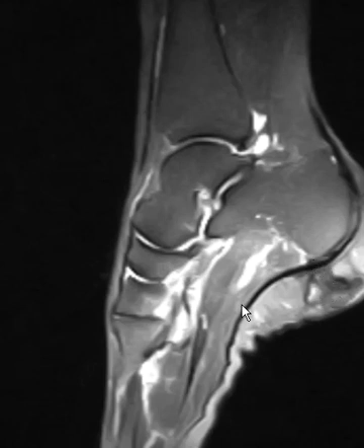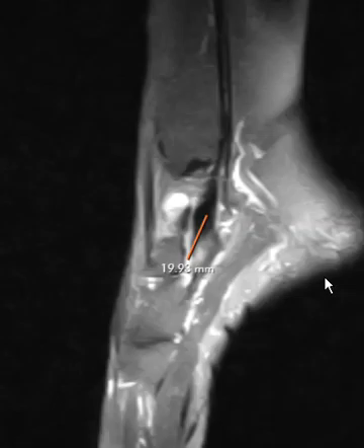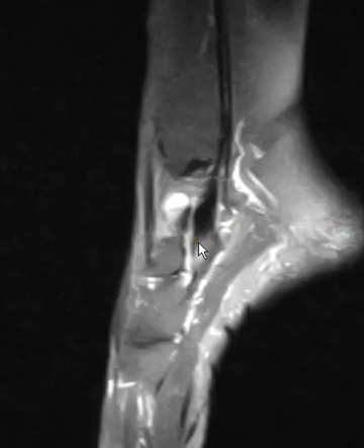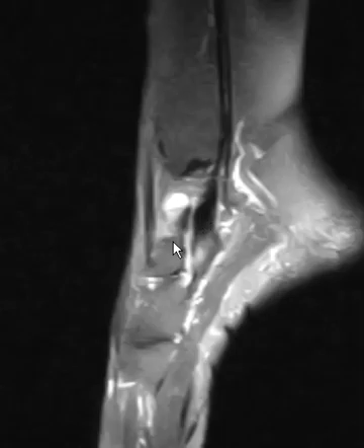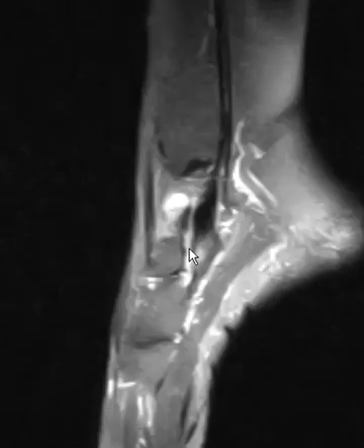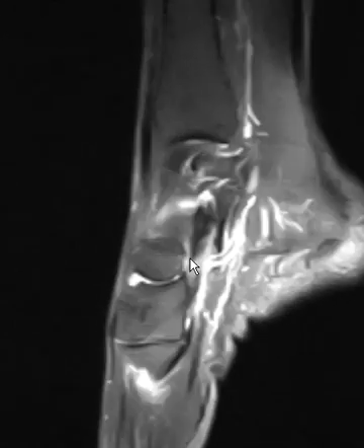The plantar fascia looks normal, but she doesn't have any symptoms here. Her symptoms were all along the medial aspect here, and I put a marker over the area. This is the posterior tibial tendon coming down, and it should attach right here on the navicular bone. We see the posterior tibial tendon doesn't look like it makes it quite there — it looks like there's a bright signal right there, so this is a high-grade partial or almost a complete tear at the navicular attachment.